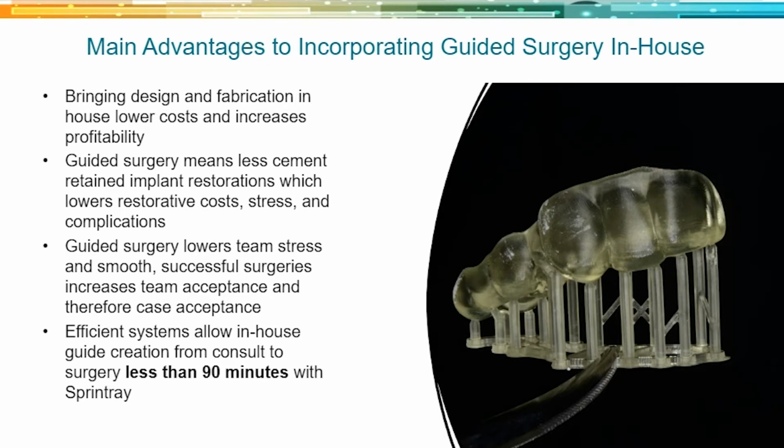And then we'll talk about a case I did that you can go from consult to surgery in less than 90 minutes with guided, with in-office SprintRay materials. So we'll have a case where a young woman came in with a broken tooth, and in less than 90 minutes we were able to do the surgery fully guided, which is maybe the time for them to have a seat, get an x-ray, get the patient numb, get the tooth out, and you finish up your other patients because you squeeze this one in. So we'll talk about that example and how it works.